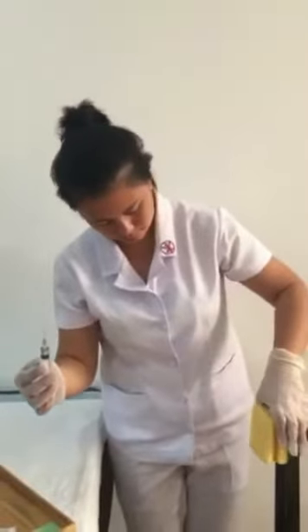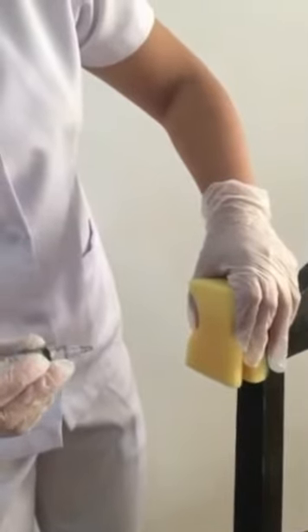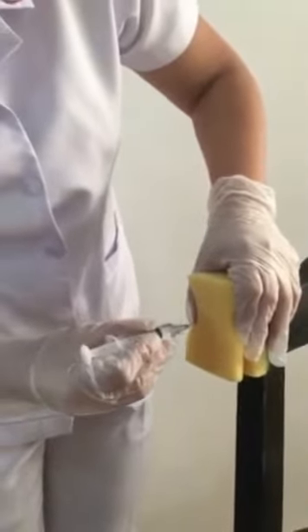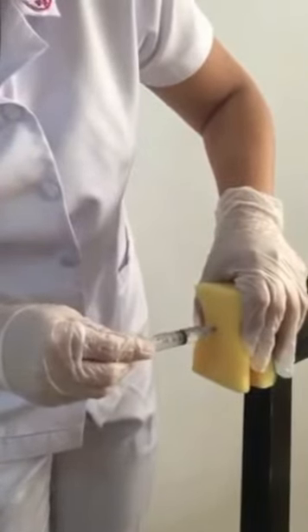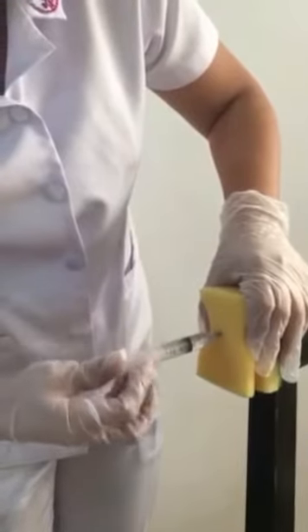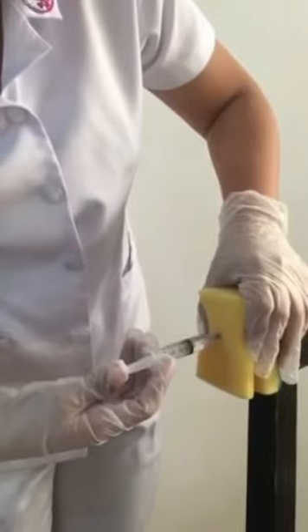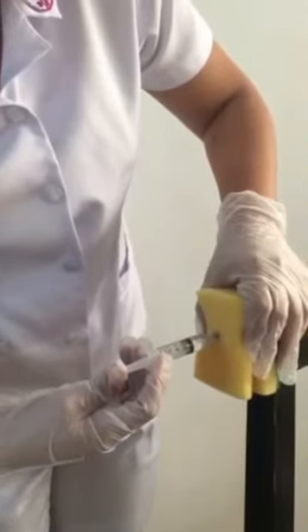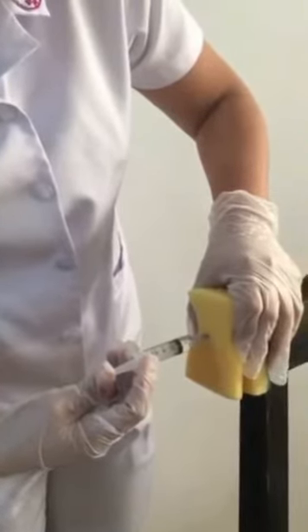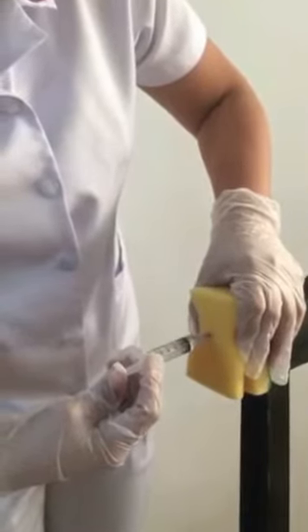Injects the medication using the Z-track technique. Uses the ulnar side of the non-dominant hand to pull the skin approximately 2.5 cm to the side. Under some circumstances, such as for an emaciated client or an infant, the muscle may be pinched, pulling the skin's subcutaneous tissue or pinching the muscle. Makes it firmer, facilitates needle insertion, holding the syringe between the thumb and forefinger. Pierce the skin quickly and smoothly at a 90-degree angle and insert the needle into the muscle using quick motion. Lessens the client's discomfort.